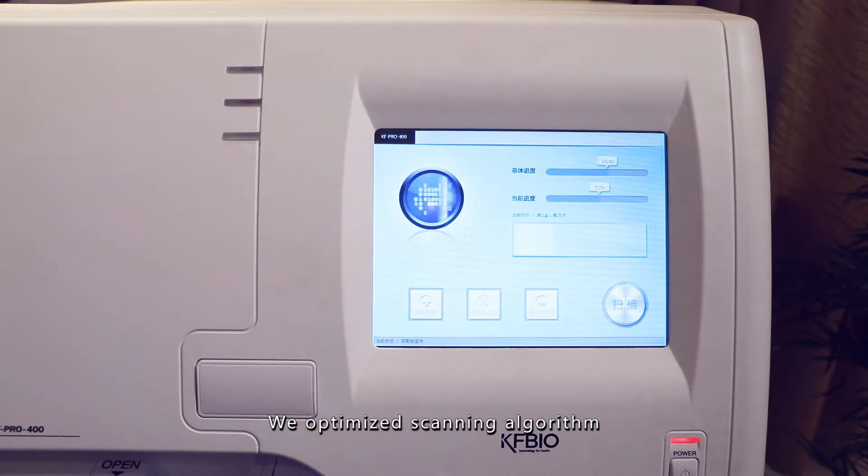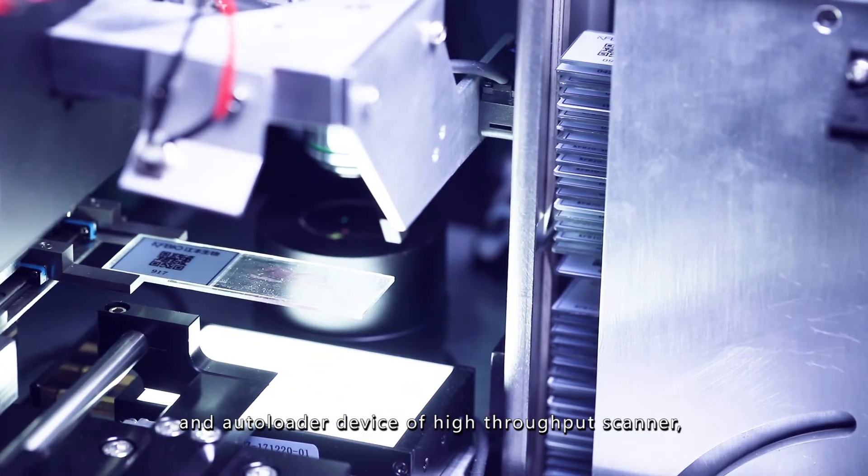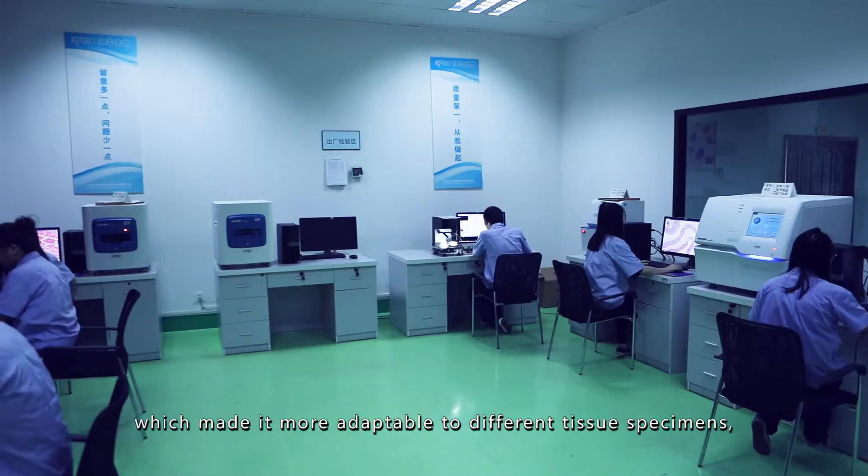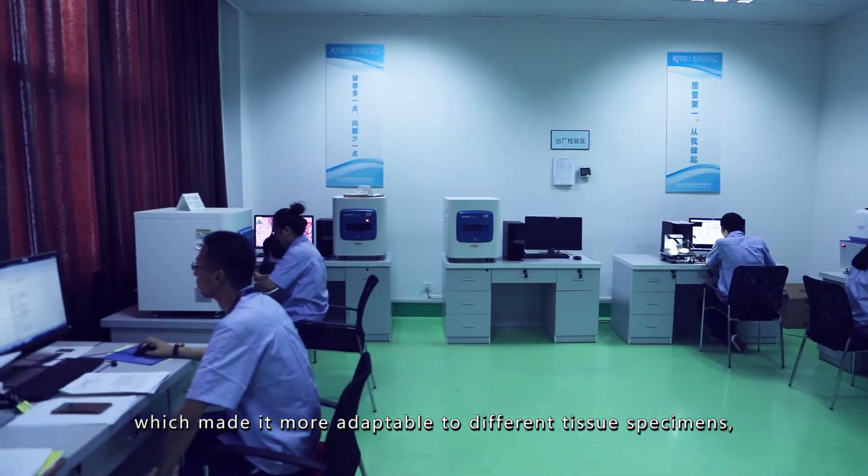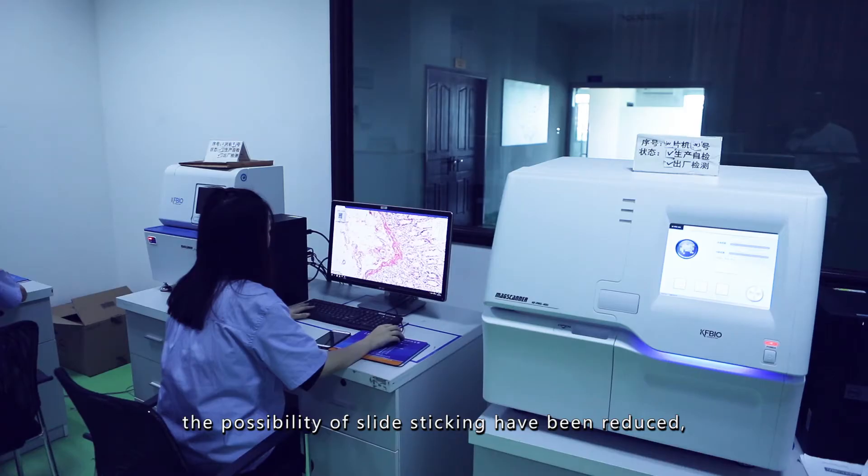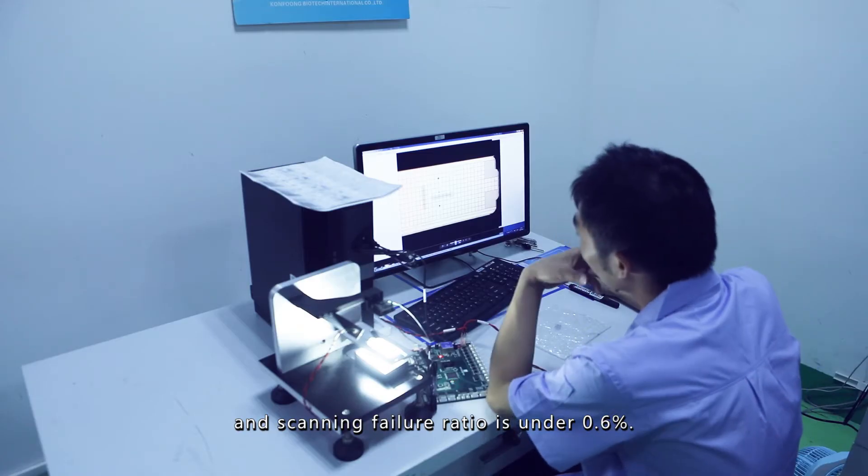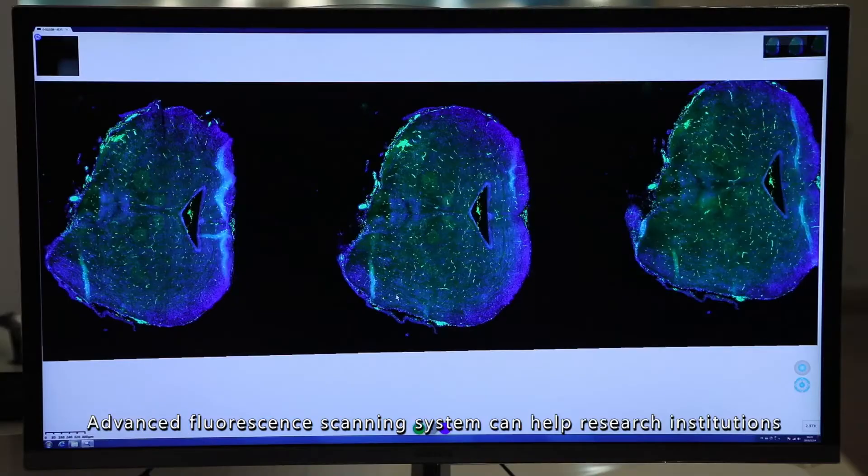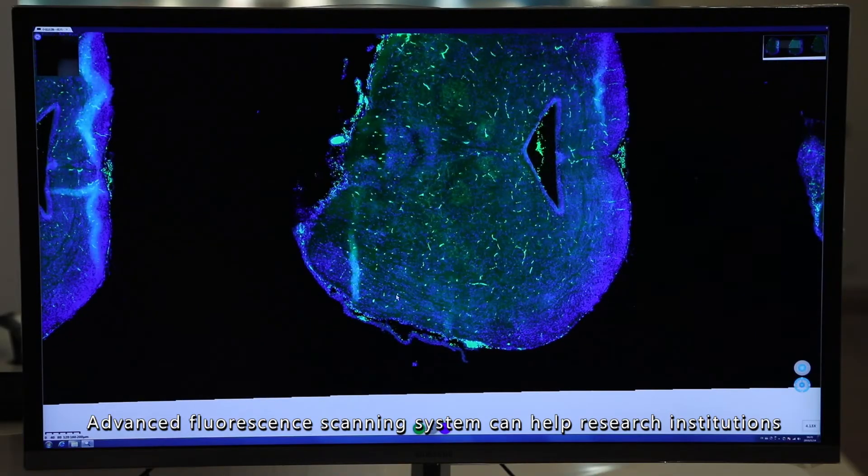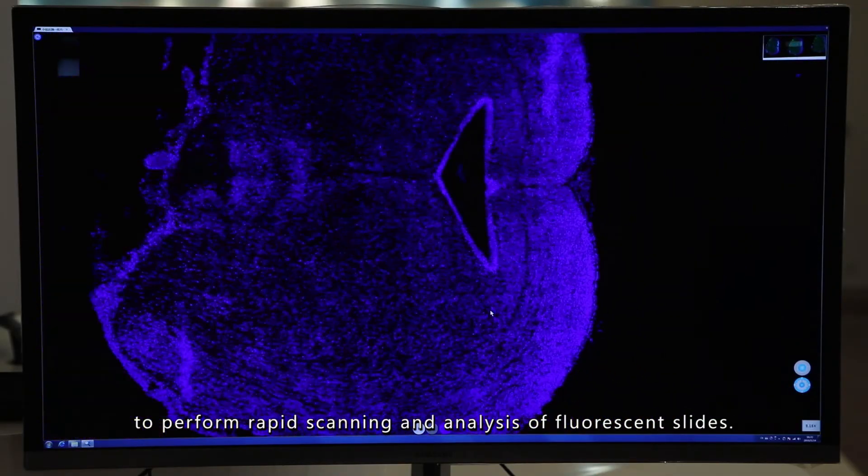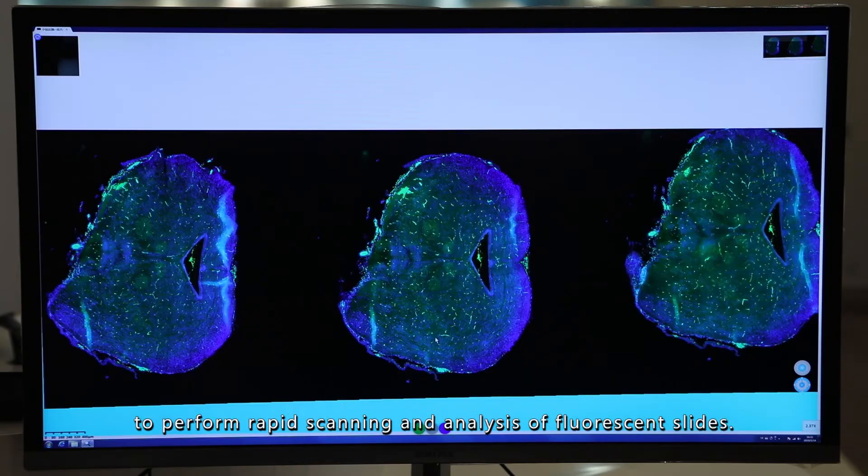We optimize scanning algorithm and auto-loader device of high-throughput scanner, which made it more adaptable to different tissue specimens. The possibility of slide sticking has been reduced, and scanning failure ratio is under 0.6%. Advanced fluorescence scanning system can help research institutions to perform rapid scanning and analysis of fluorescence slides.